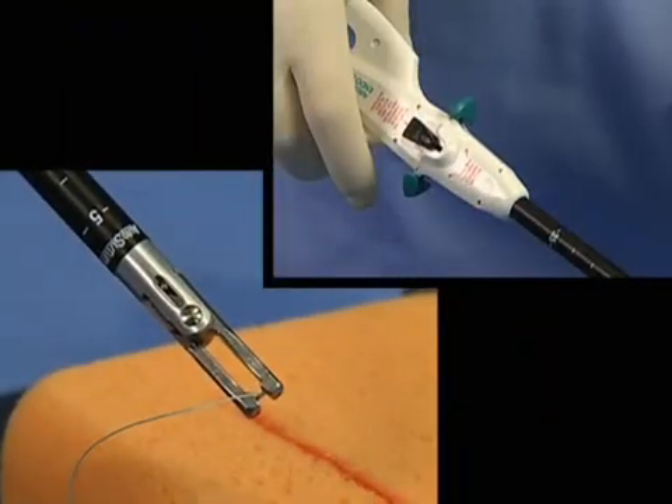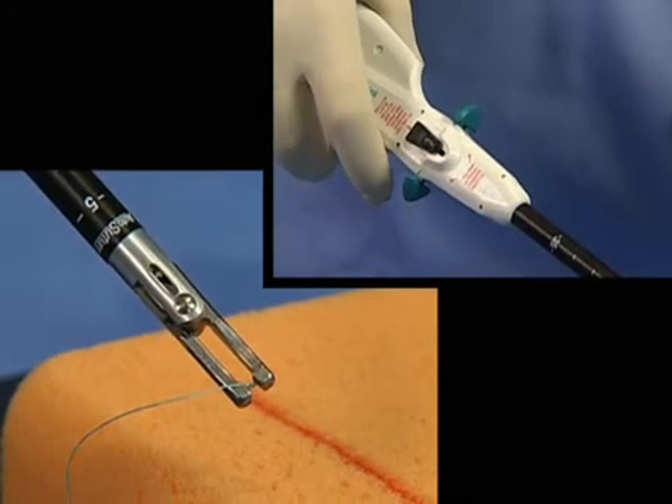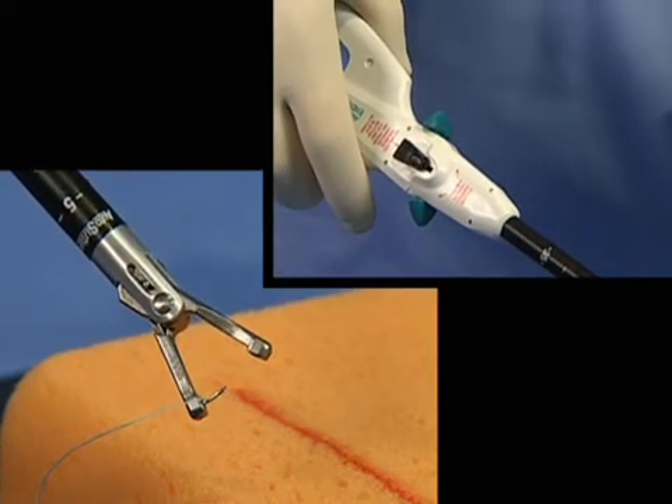Once the device is inside the body cavity, the jaws are opened by squeezing the handles and pushing either toggle lever completely forward. Once the handles are released, the needle is exposed and ready for use.